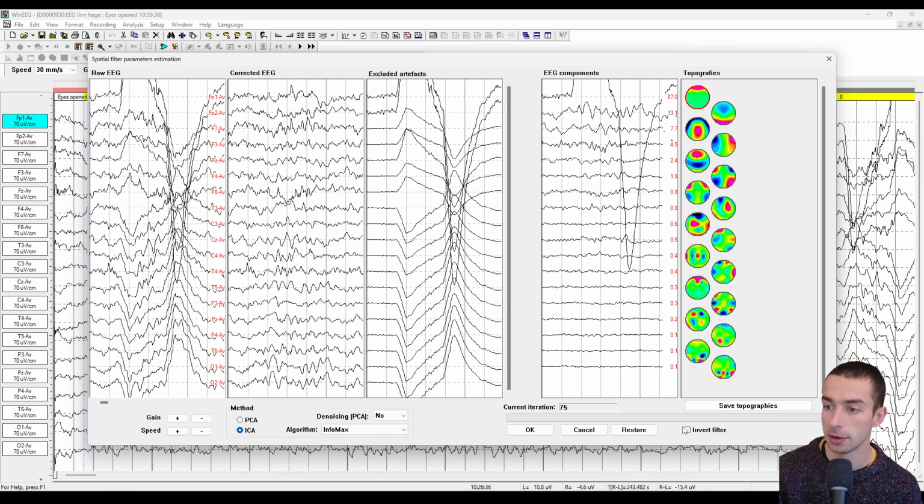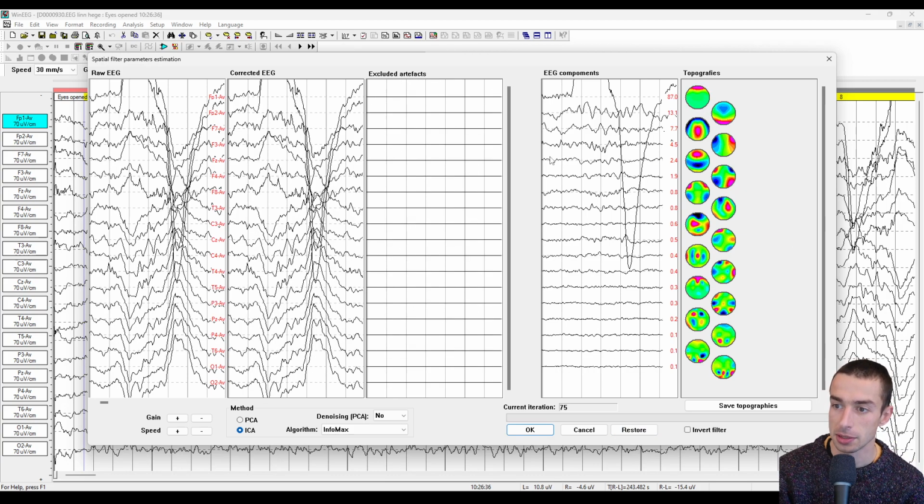And you'll notice over here that we have topographies. And so you might be thinking, well, hey, why do we have topographies over here when we already know that each one of these channels corresponds with a specific sensor on the scalp? And that would be a good question. These are actually two separate parts of this window. So these three bins right here, each of these lines corresponds to one of these channels over here. So FP1, FP2, etc.